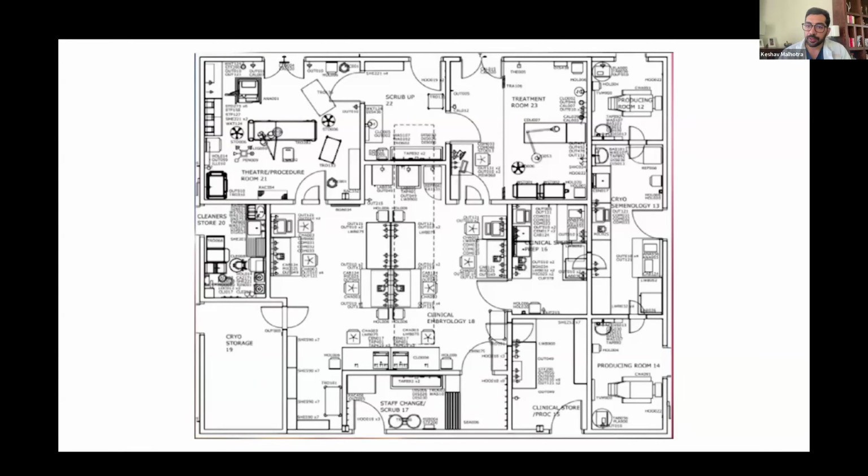It was very different, just a compact room with all sorts of equipment placed in one room itself. There was no sense of VOCs. Nobody really cared much about air quality, particulate matter, the flow of the laboratory, or ergonomics.